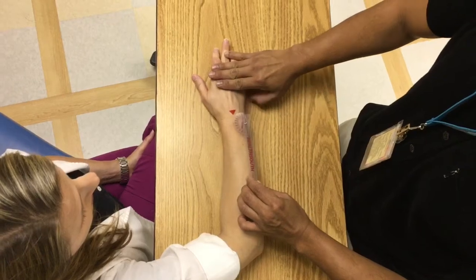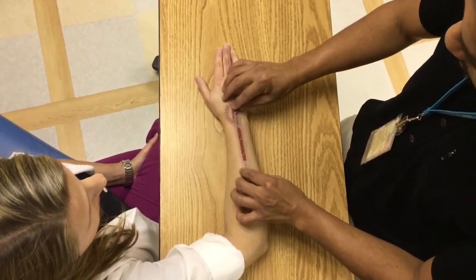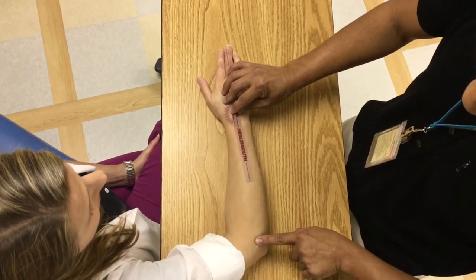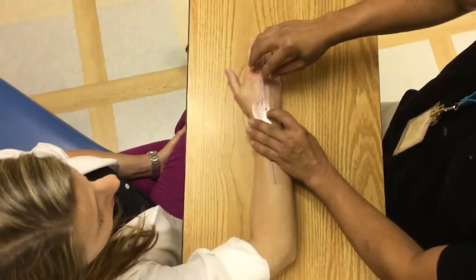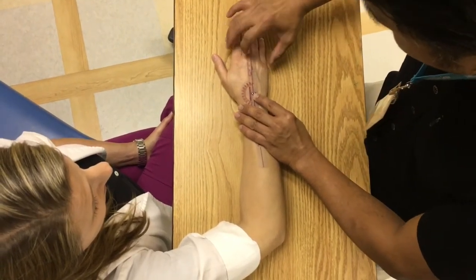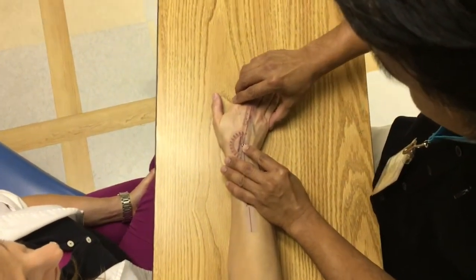Okay, relax. All right, so let's put the goniometer on the capitate and align it towards the lateral epicondyle, the non-moving arm. And then let's start with the ulnar deviation first. Stephanie, go ahead and turn your hand towards me.